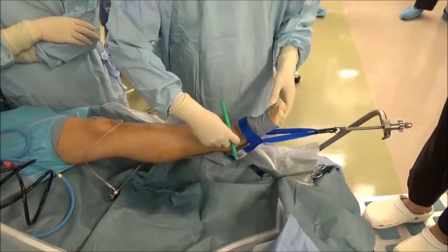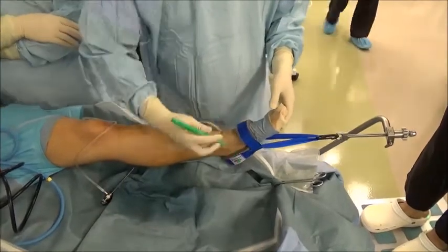At first, we mark the anterior tibialis tendon and joint line.